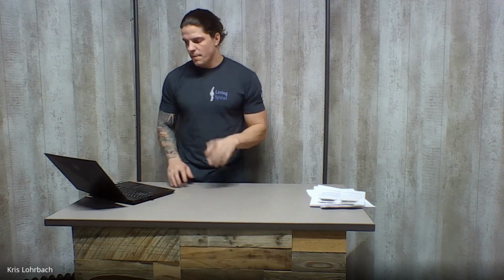One more thing to say about foam. Generally it's not the best at pressure redistribution, and it can bottom out. If you bottom out a foam cushion, it's just not the right cushion. You can't alter it. It's just the wrong cushion. So that's something to talk about with people: have you ever used a foam cushion before, and what kind did you use, and what happened?